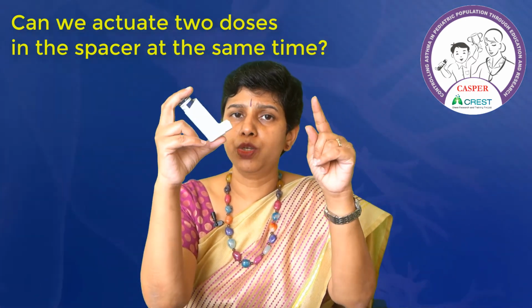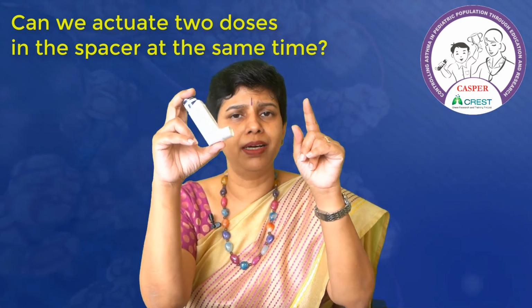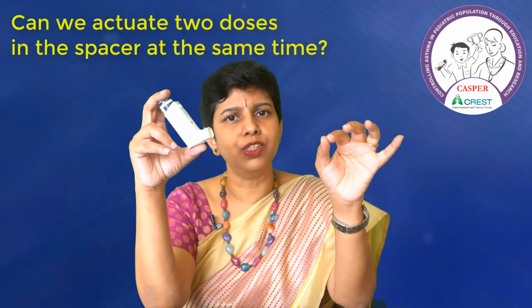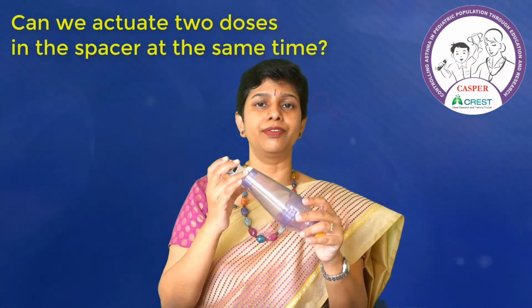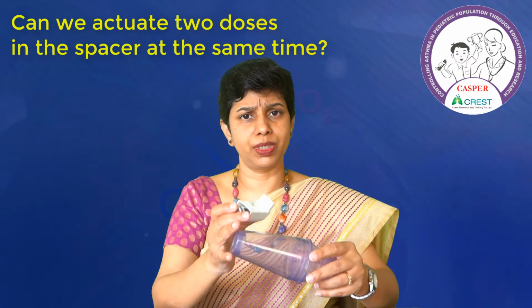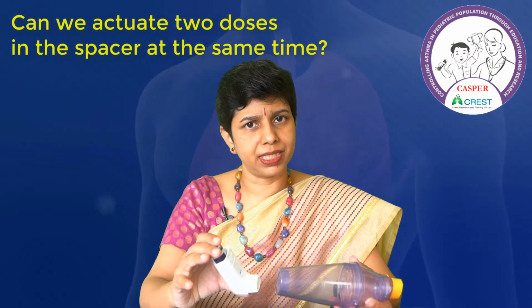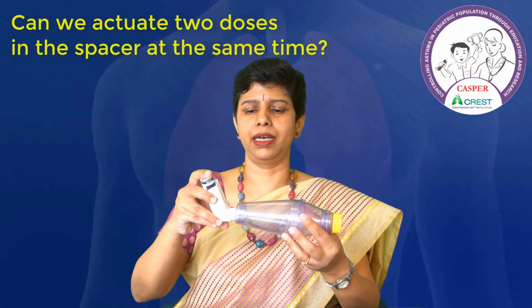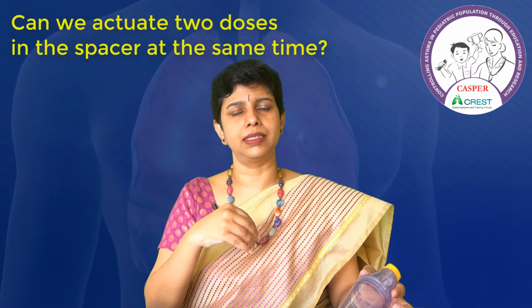So between 2 dosages or between 2 actuations, there should be a gap of minimum 30 seconds to 1 minute. Whenever you have to give 2 dosages, for example in an acute exacerbation, you have to repeat all the steps: shake, connect, hold, actuate, and ask the child to inhale. So all the steps have to be repeated.